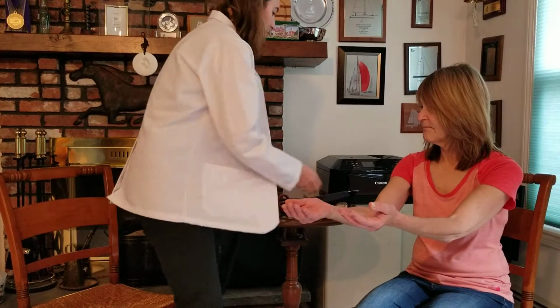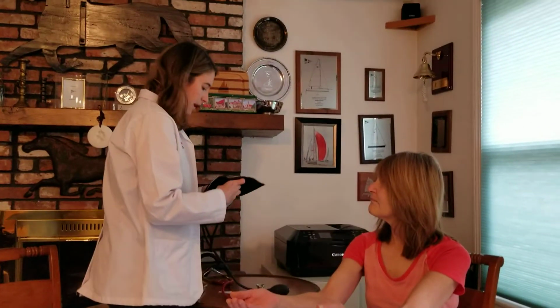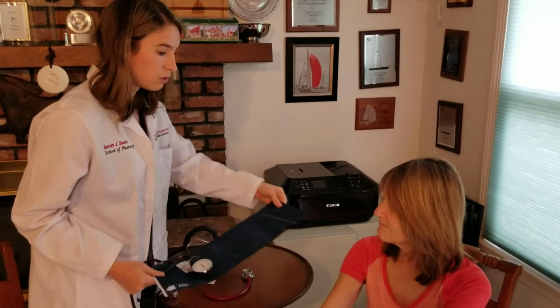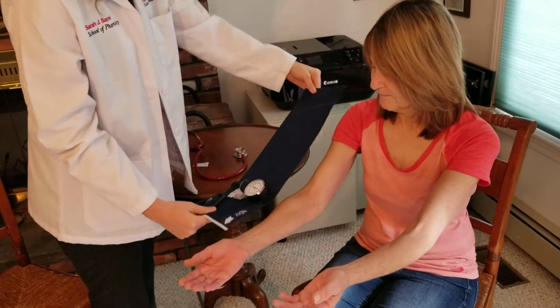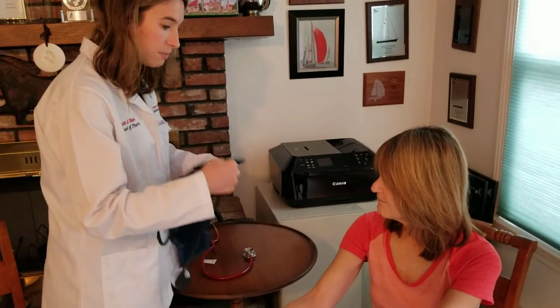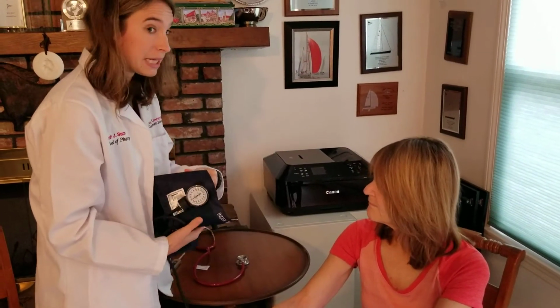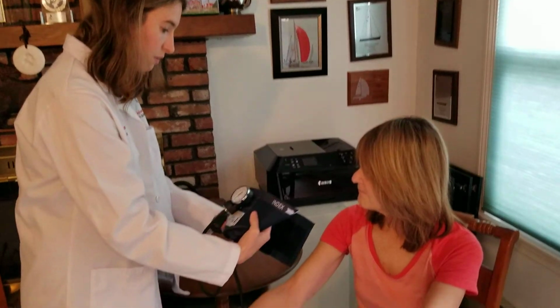Okay? So the first thing that I'm going to do is make sure that the blood pressure cuff is the right size for you. The length should be about 2/3 the length of your arm. The width should be about 40% of the length of your upper arm. And then the bladder should be at least 80% of the circumference of your arm.